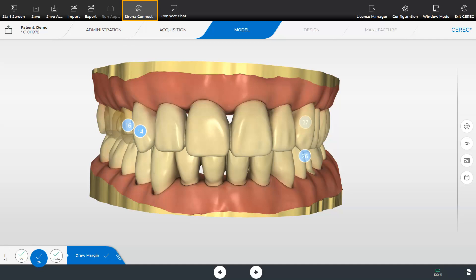With the seamless workflow with in lab and the validated workflow with ExoCAD the preparation margin is transferred in addition to the model data. Then the lab can either design and fabricate the restoration or in the case of an in lab software create only the design and send back the model and restoration data for import into the CEREC software via the connect chat.